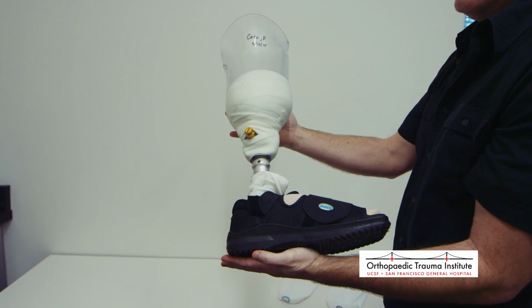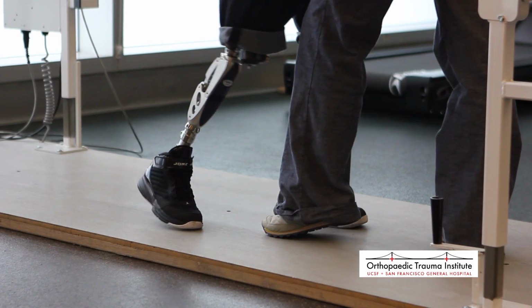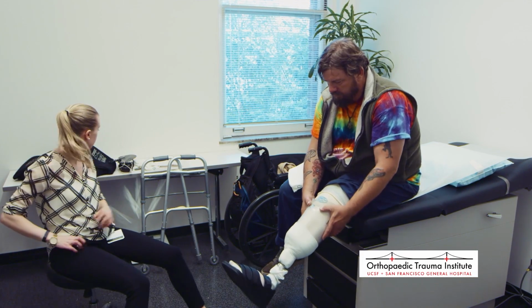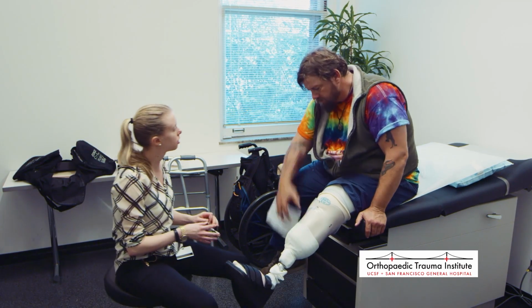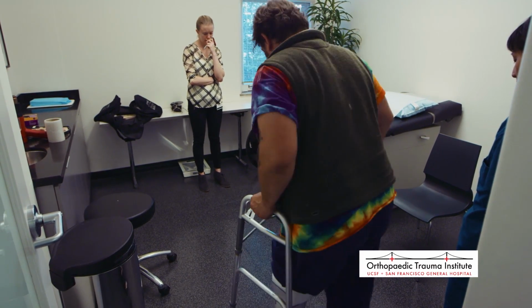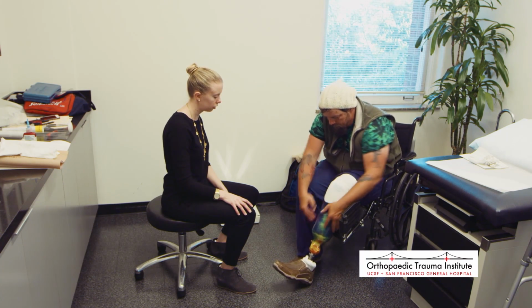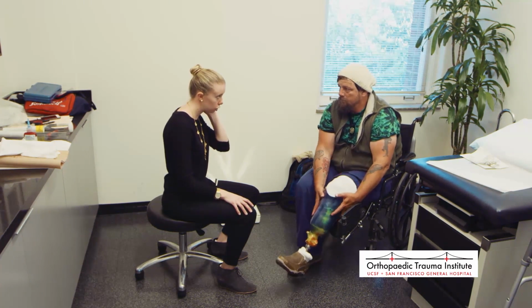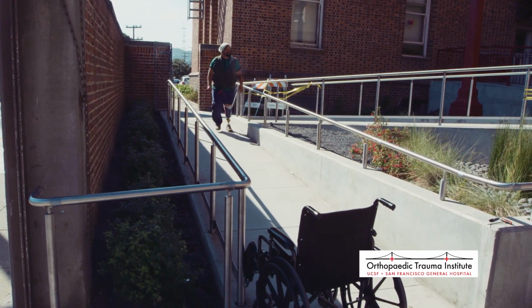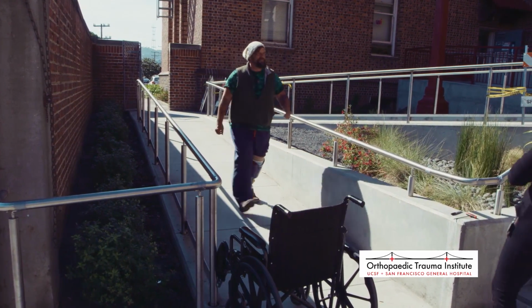Once we have a very comfortable fitting with just the socket, we'll attach whatever is needed underneath. So whether that's a knee, if you're an amputee above the knee, or just a foot, that socket is the attachment point for all those things. So we'll attach those in the initial socket fitting and have the patient walk, make sure it's comfortable, sometimes send them home on it, sometimes just do it in the office. And then once that whole system is comfortable and stable, then we'll go to a final socket made out of fiberglass or carbon, and that carbon socket is more durable and isn't going to be easily adjusted, but it'll last as long as needed.